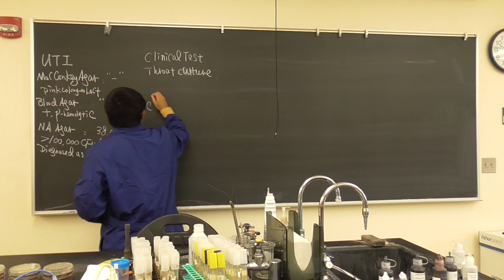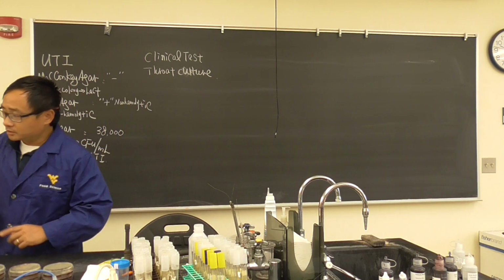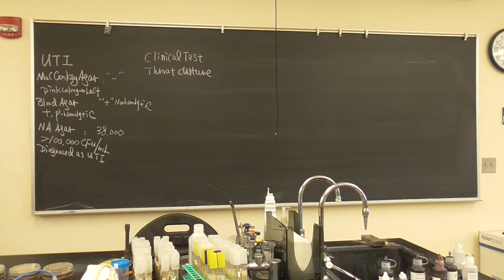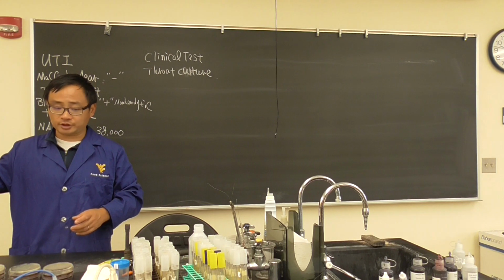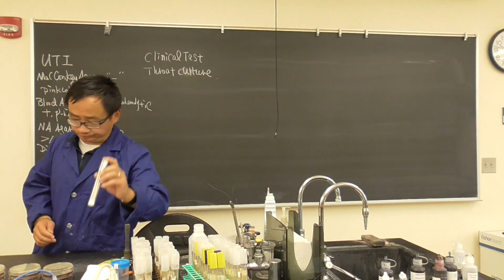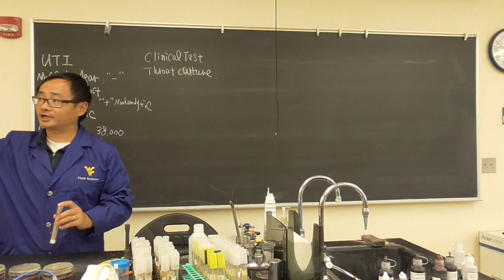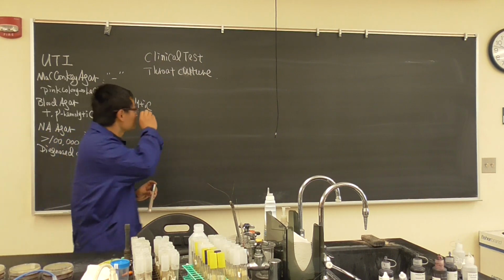So how to do the throat culture? Two of you are going to work together. We have a sterilized cotton swab right here. So two of you work together, get one cotton swab, and one blood agar. Okay, that's the first thing.